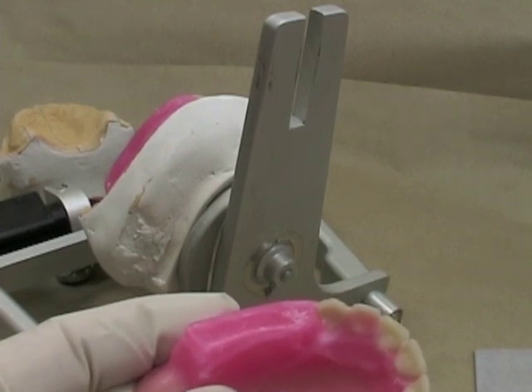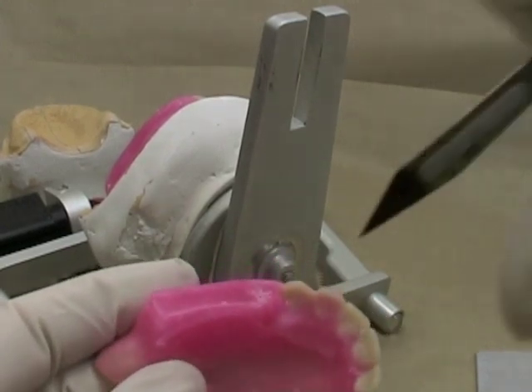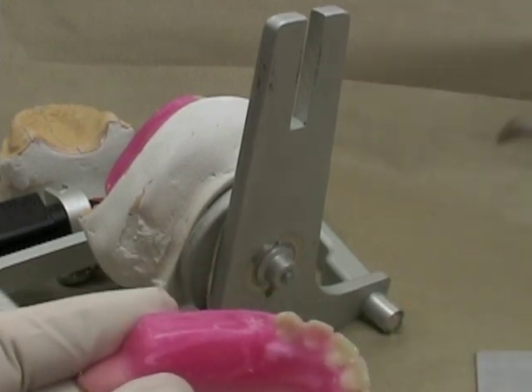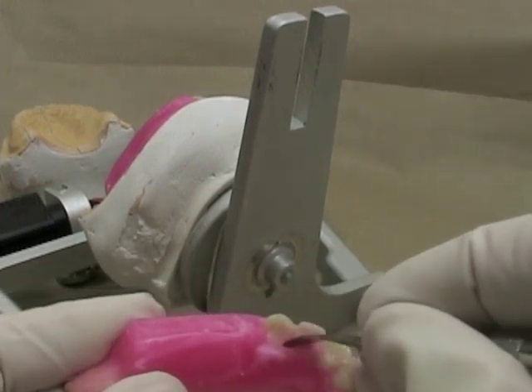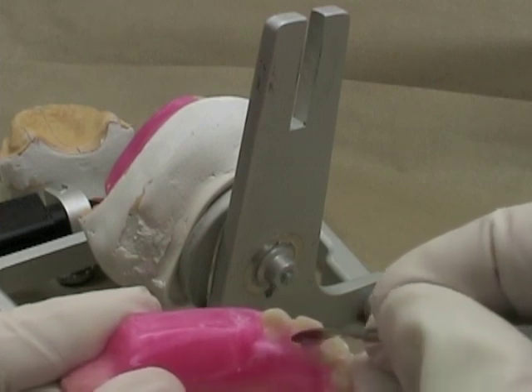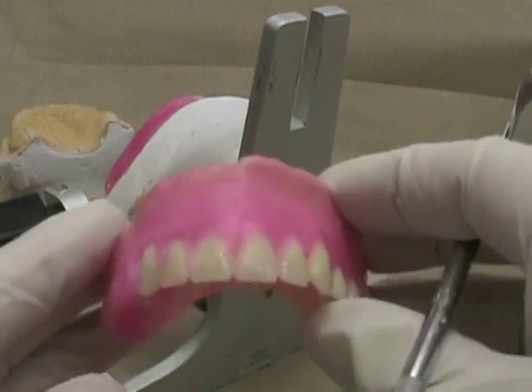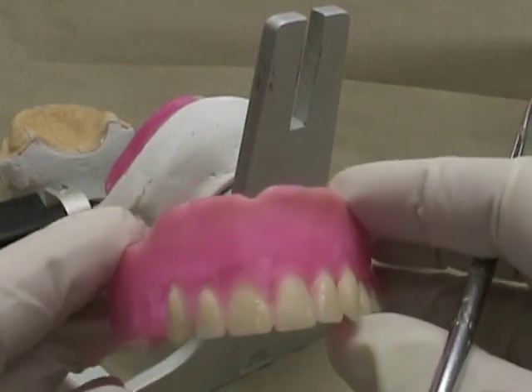I'm going to clean up a little bit of the wax around the lingual surface of those teeth so I don't have so much bulk. When I go to set the posterior teeth I may have to move the anterior teeth just a little bit, so you want to keep things neat and tidy so there's very little work left to do when finished.